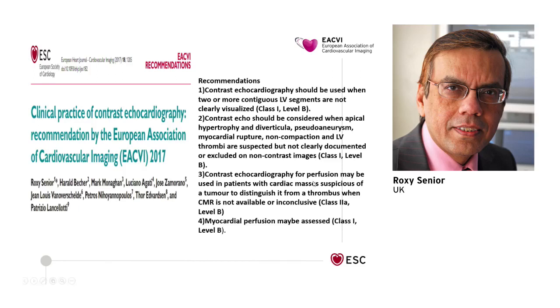And also perfusion should be performed to characterize cardiac masses, because you may have a mass which could be a tumor, not a thrombus. So if there is no vascularity and no perfusion in that mass, this is likely to be a thrombus, and under the circumstances of high thrombogenicity in this population, treatment can be applied appropriately. And one can also assess perfusion to look at microcirculation, as has been alluded to by Bernard previously, and also to distinguish ischemic versus non-ischemic cardiac dysfunction.